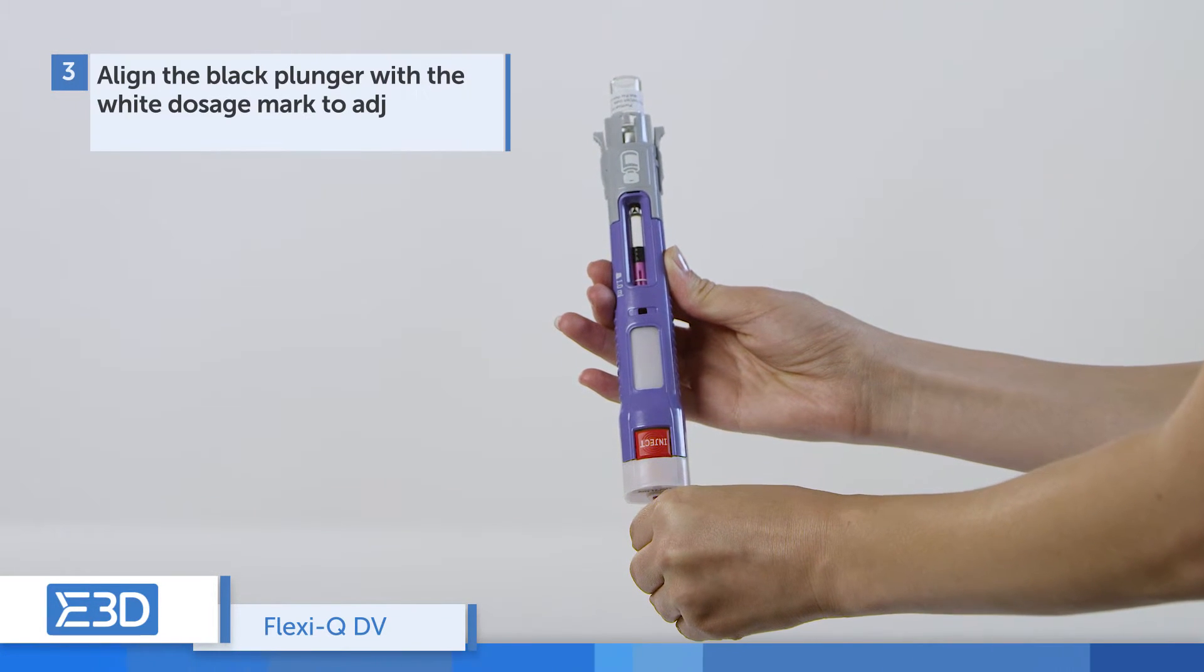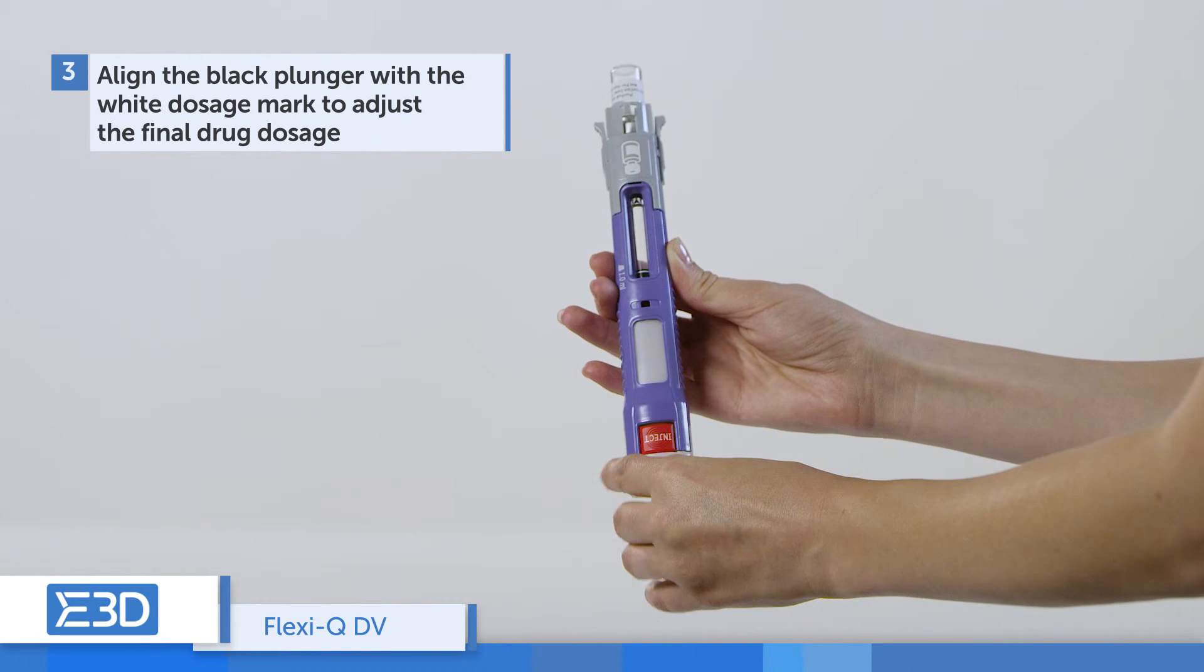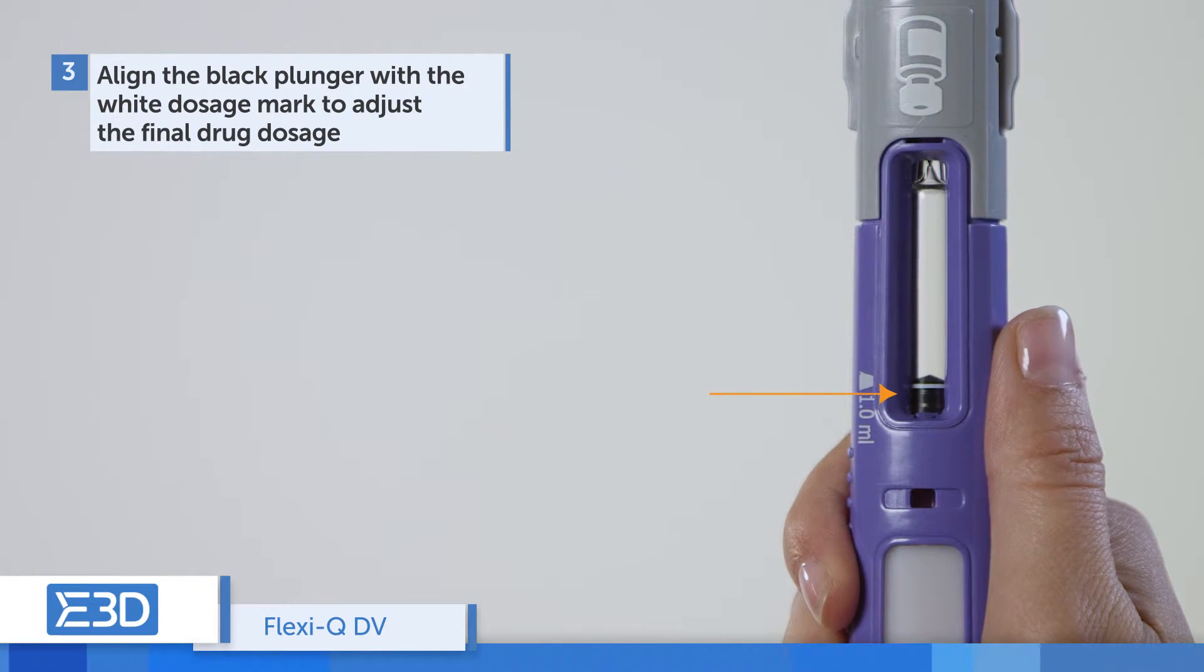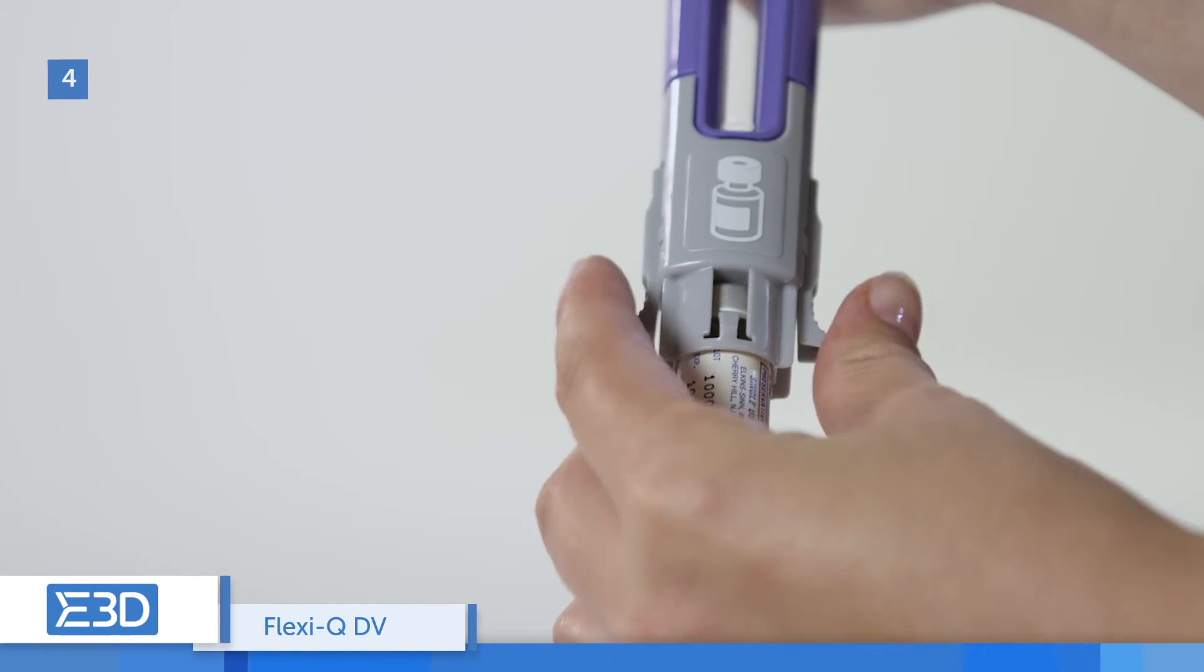To adjust the final drug dosage, align the black plunger with the white dosage mark on the device. Remove the vial adapter.